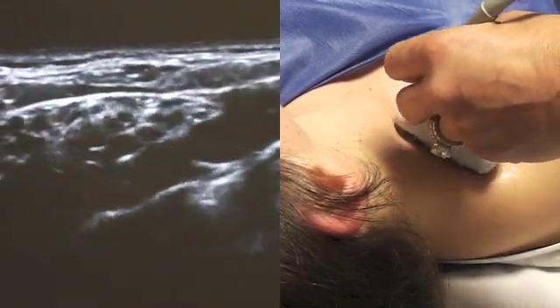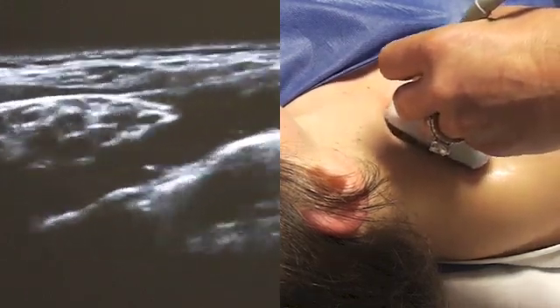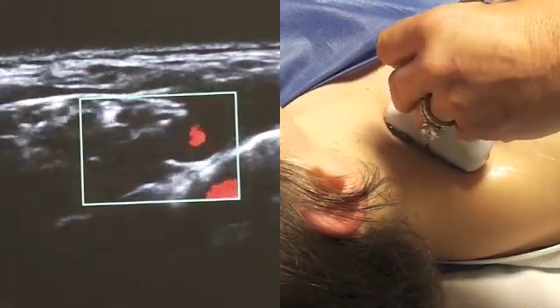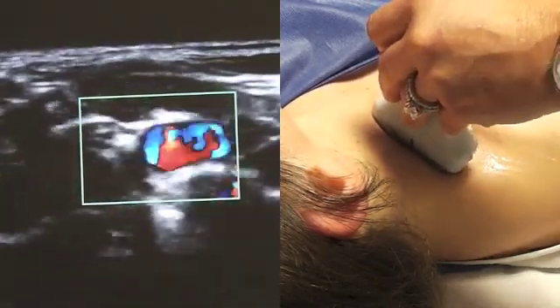This model has a beautiful supraclavicular plexus view on ultrasound. In the middle of the screen, you can see the subclavian artery pulsating. We can confirm with color Doppler. Very often, if you don't have the probe in the right position, it appears as if you have two arteries and you get some artifact.